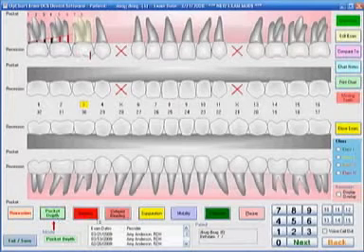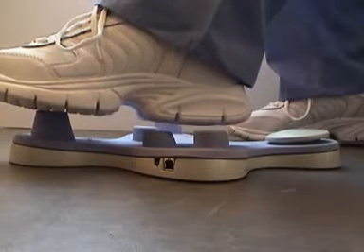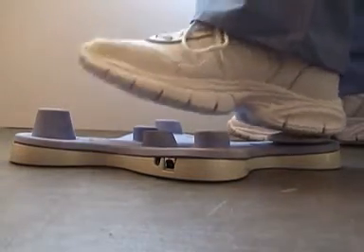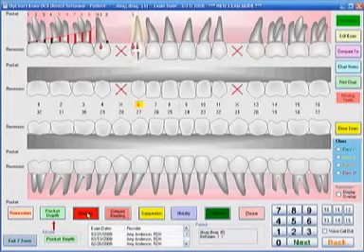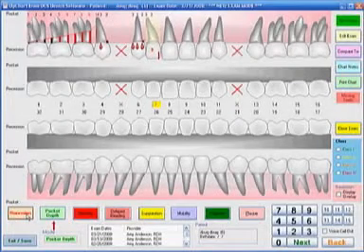For numbers higher than eight, take your mouse over to the lower right portion of your screen where there are numbers nine and above. Place your mouse on the nine and then click back with your heel and a nine is entered. If you have a 14, take the mouse over to the 14, rock back with your heel and a 14 is entered. You can also mark bleeding at the same time — just rock back with your heel when the mouse is on bleeding and quickly go through a Perio chart marking bleeding as you go. If you have areas of recession, take your mouse over to the recession, rock back with your heel and then enter the recession that correlates with that tooth.